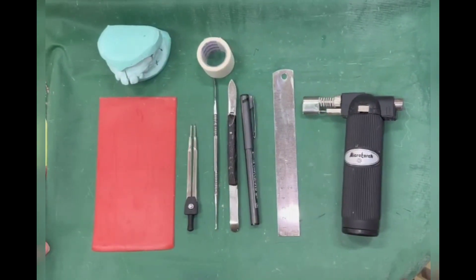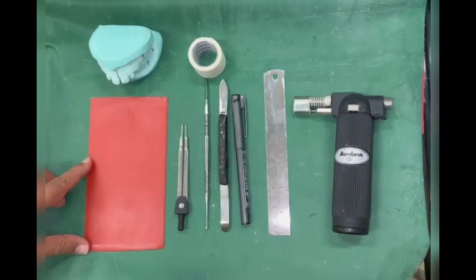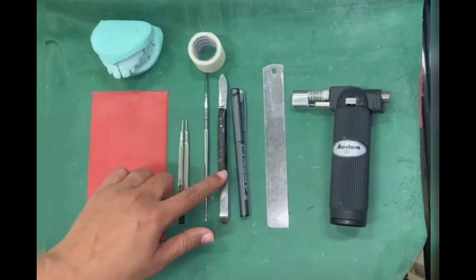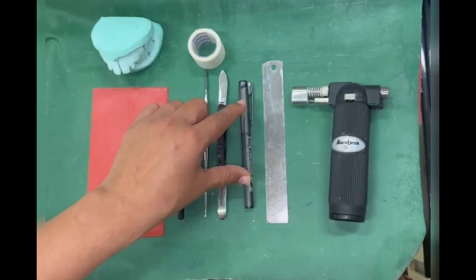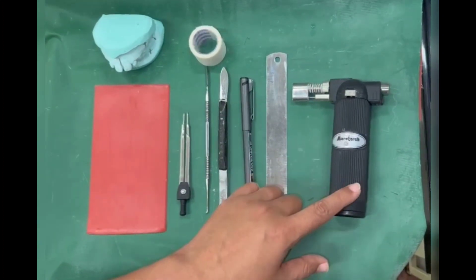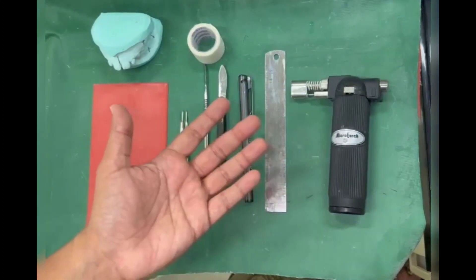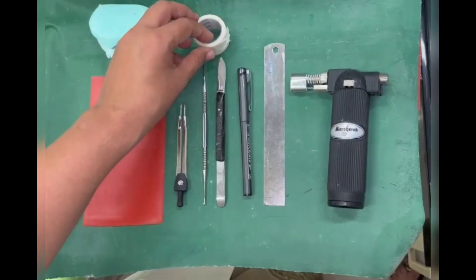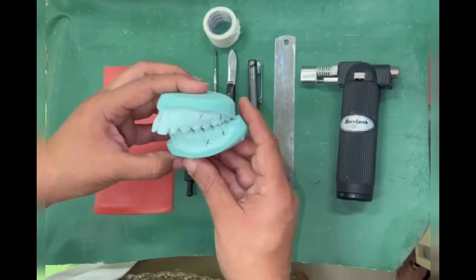The armamentarium required for bite registration is a wax sheet, a divider, a Lecron carver or a wax knife, a marking pen to put marks on the patient's face, a measuring scale, a source of heat which could be a soldering torch, a spirit lamp, or warm water to uniformly heat the wax sheet, and micropore to put marks on the patient's face. Also required are study models of the patient, which should be without bases.